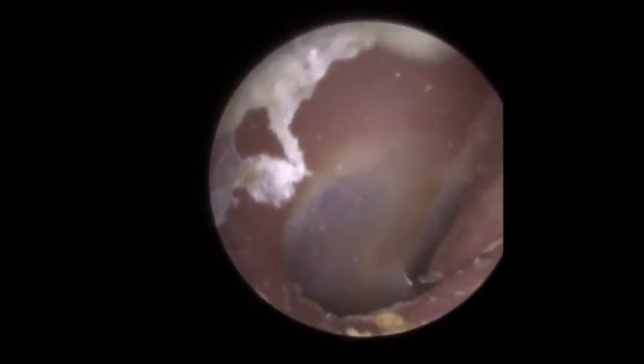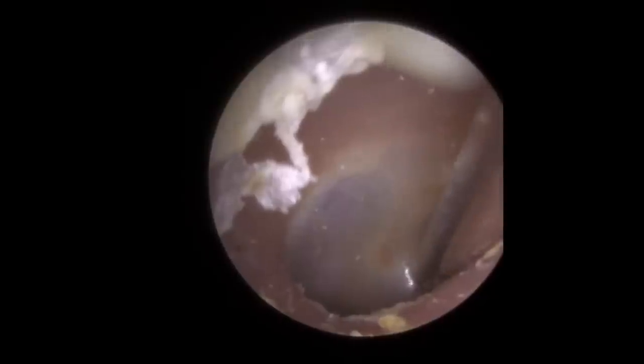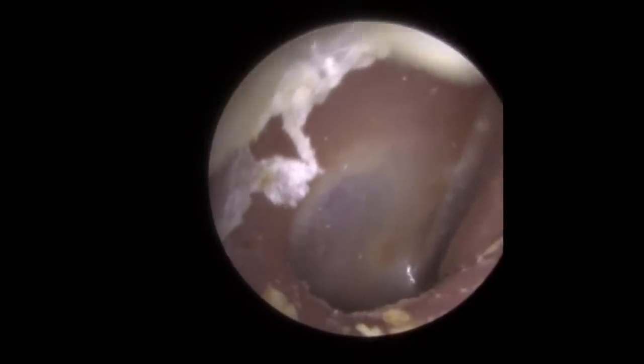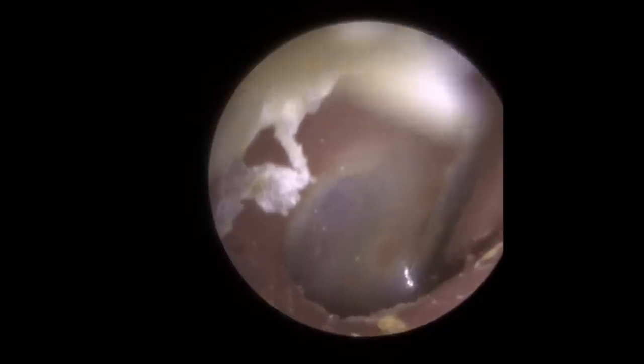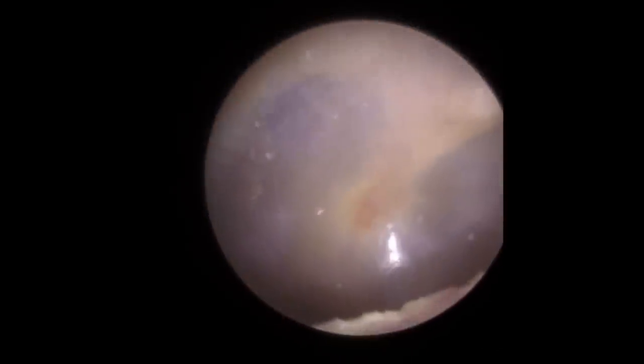There is another piece a bit further in. We talk about this valley in front of the eardrum quite a bit — you can only just about see the leading edge, which makes it a difficult place to take wax away from. We've got the fine end on here, which is helpful. It's very delicate — we're trying not to press too hard against the canal wall, trying not to touch the eardrum, working in a very, very tiny space. There's that piece. That eardrum looks nice and healthy now.